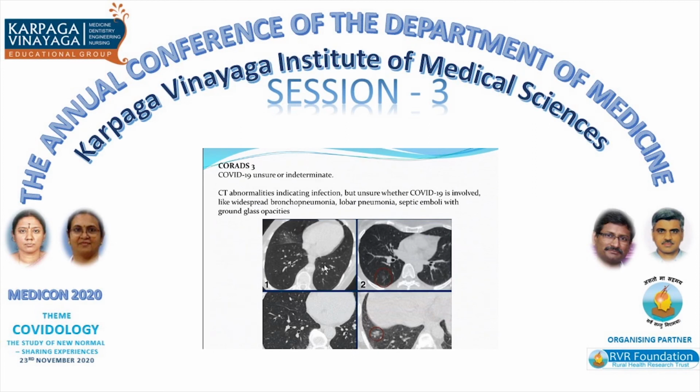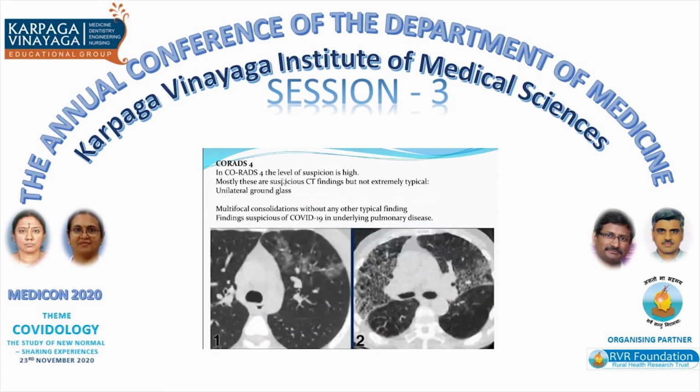So all kinds of bronchopneumonias, lobar pneumonias, or septic emboli will give these ground glass opacities. But if you don't have a proper history, some radiologists may label this as a CORADS 5, and then the patient may have treatment, and the apprehension is also more for the patient, because it's detected as a COVID when he's really not. So we have to be careful for this CORADS 3. Even in CORADS 4, the level of suspicion is high.